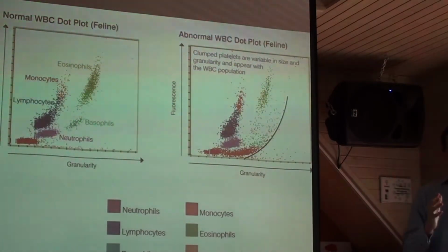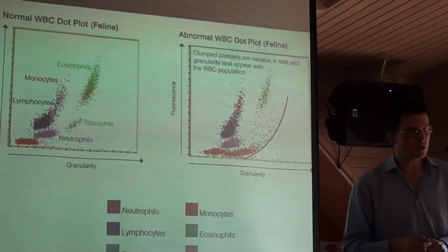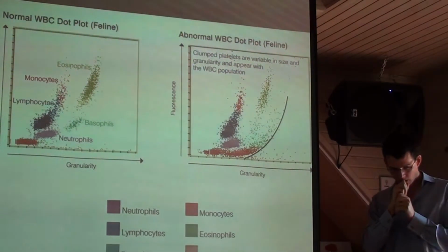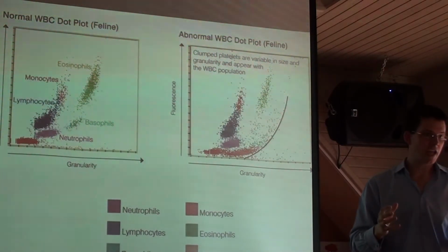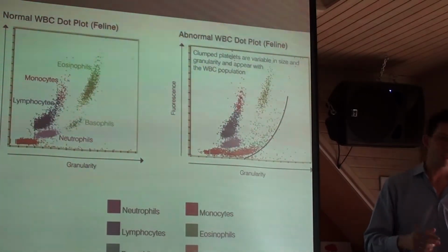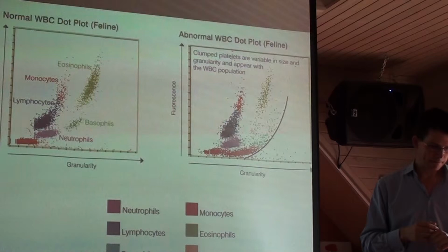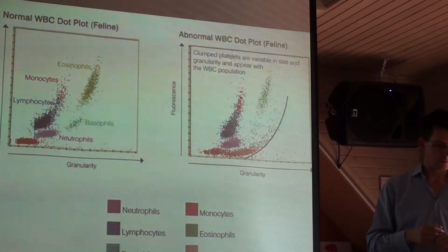As I said earlier, we're not going to dwell too much on the graphical report, but I did want to point out a few salient features. Ei taha väga palju tegeleda nende graafiliste kujutustega, kuid siiski mõned punktid välja tuua. What I say today is a basic principle of flow cytometry and doesn't just apply to the IDEX analyzers. Ta tahab rääkida sellest voolutsütomeetri üldistest põhimõtetest ja mitte isegi nii tingimata ainult IDEX-i masinast.